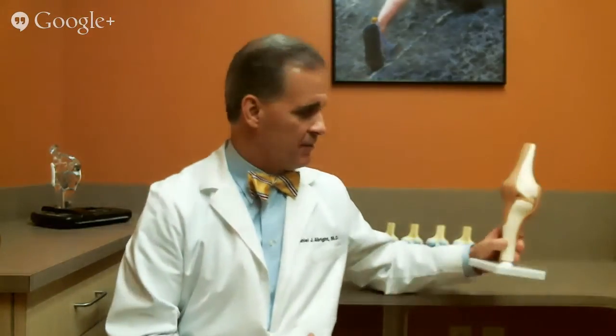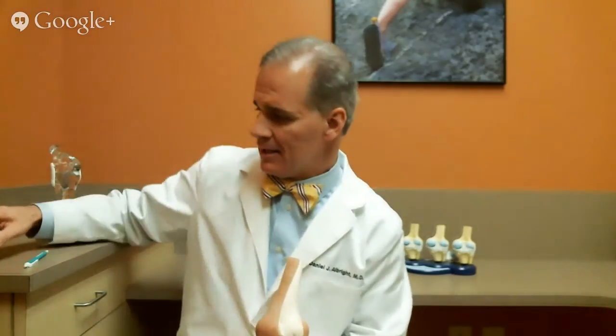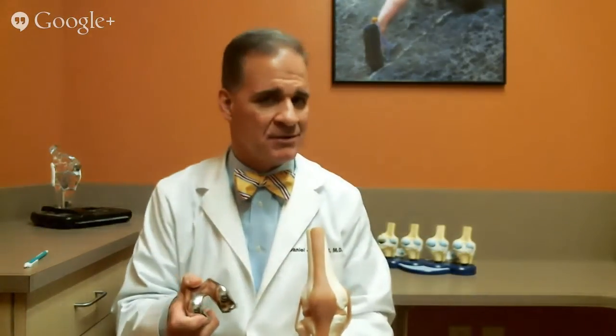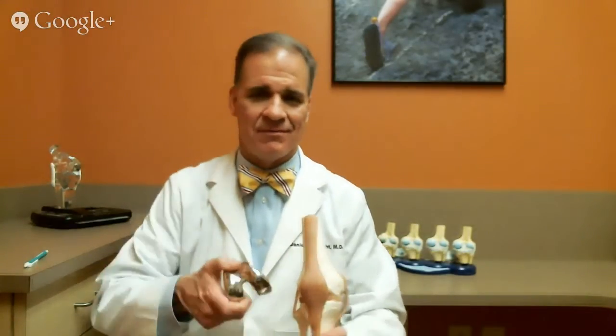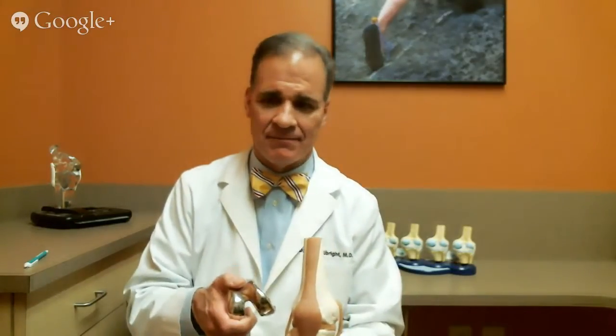So you take the end of the femur — I have a model here. The femur is the thigh bone, right here. You take about a quarter inch of bone off the end of the femur and you cement, or glue on, a cobalt chromium metal cap on the end of the femur. This is an example of that piece. All knee replacements are very similar; the actual model is not vital. What's important is that the implant has been used for years and has been proven successful.